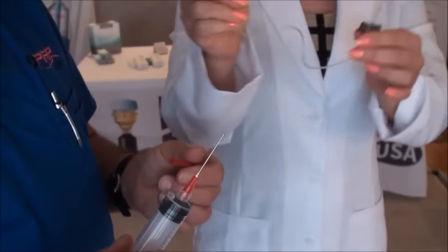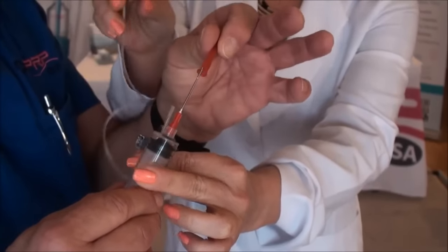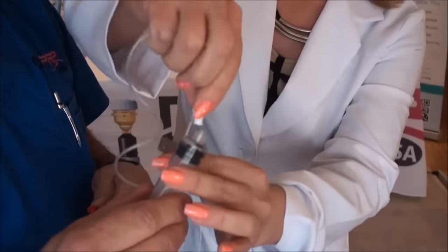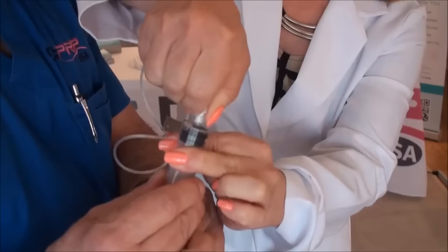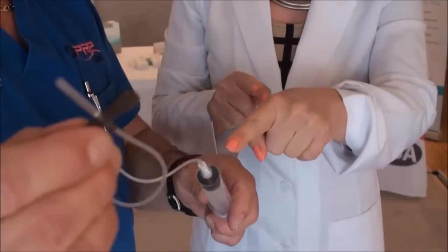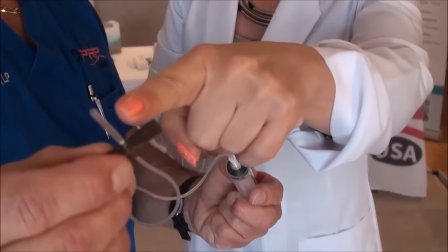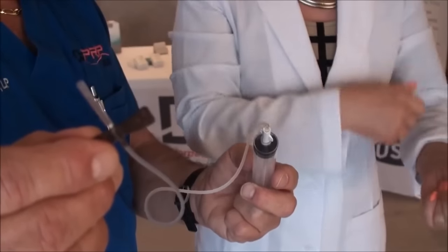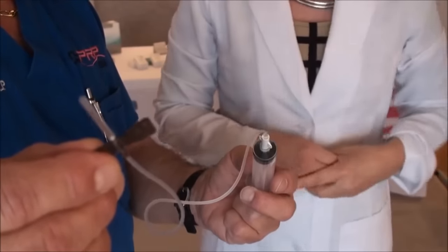The next step is to switch out the ACD needle with your blood draw needle, all of these being 18-gauge. Then you are going to push your anticoagulant through this capillary tube all the way up through the needle. So the minute that you insert the needle into the vein, the blood will automatically come into contact with the ACD.